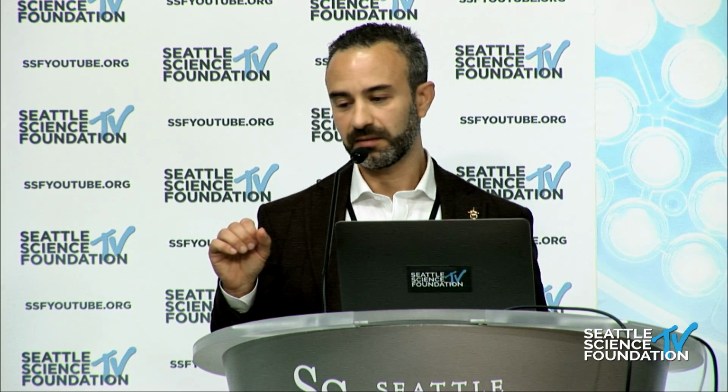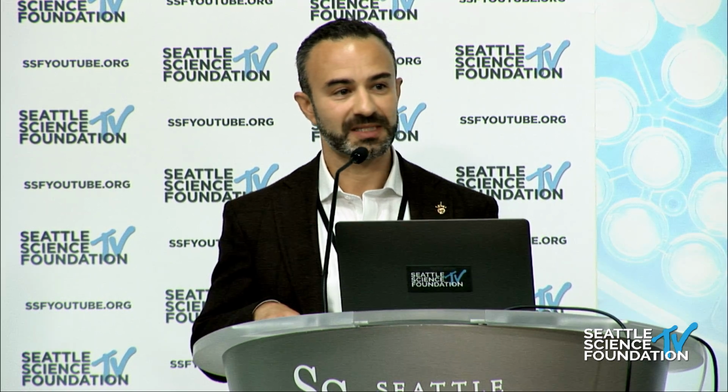Absolutely, and great question. I've had the same evolution. We have very similar training. We were both Manisha's fellows, and as you know, initially when I started practice, I would use the allograft, and we would use a screw and a washer. And the great thing about that, it is very cheap, and every ortho set, you can get it from the trauma set.